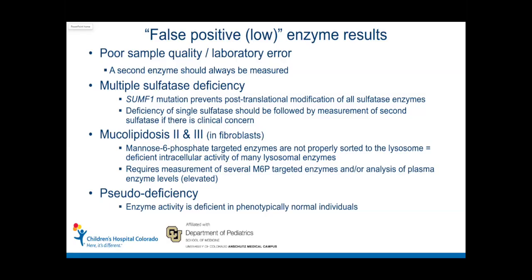They may not give you a number, but they're going to tell you that that enzyme activity was within the normal range or within their QC parameters. And therefore the sample quality is okay, and we can then use the results from the enzyme that you're interested in.